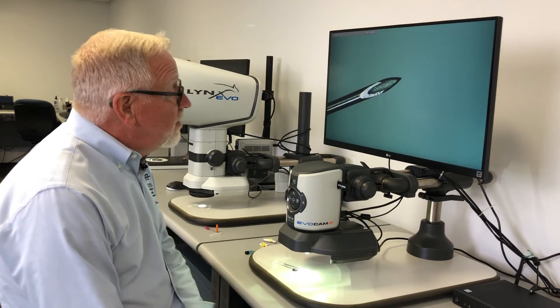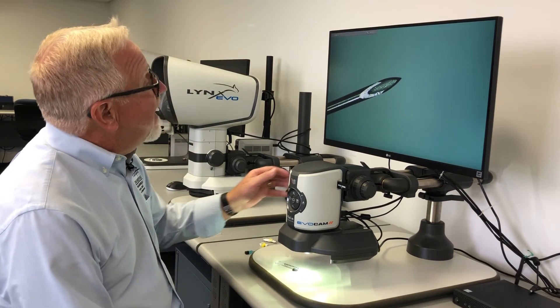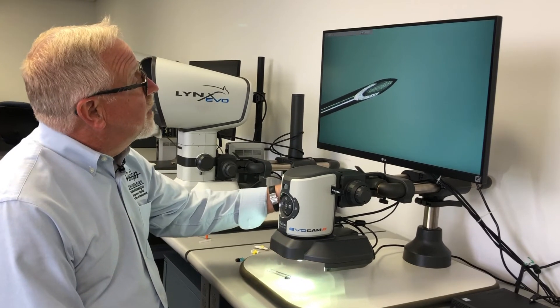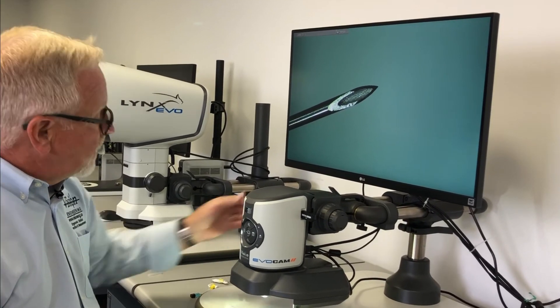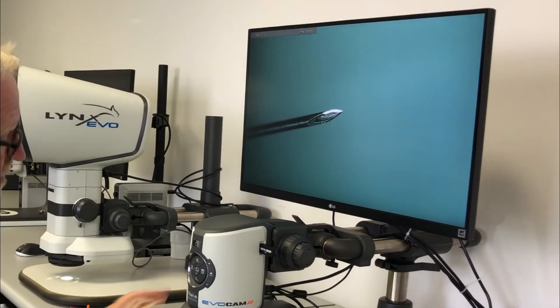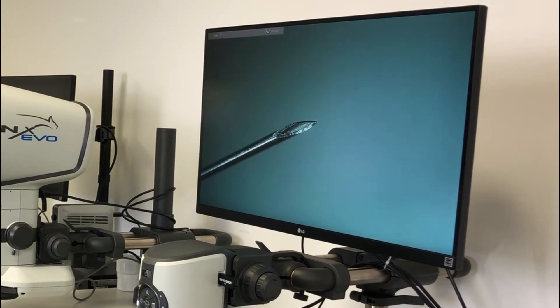Here we have a 30 gauge insulin needle. We're looking at it at a hundred times magnification. We can get the whole tip in focus, we can focus down into the barrel, and we can bring the angled view in to look all the way around that. Very easy to inspect the whole tip.